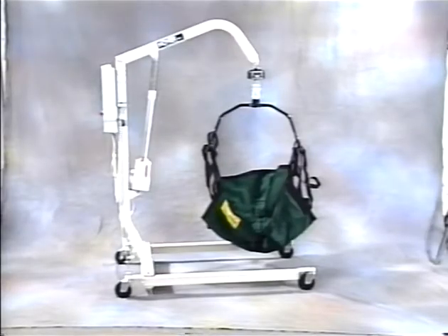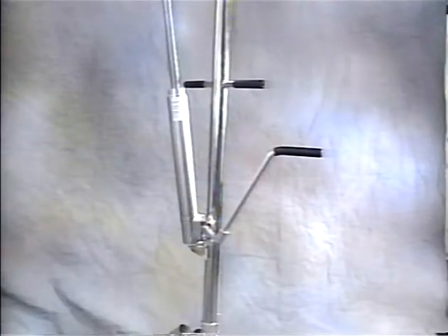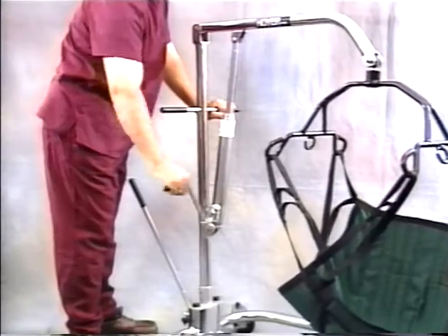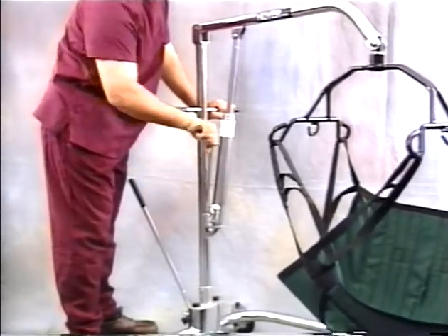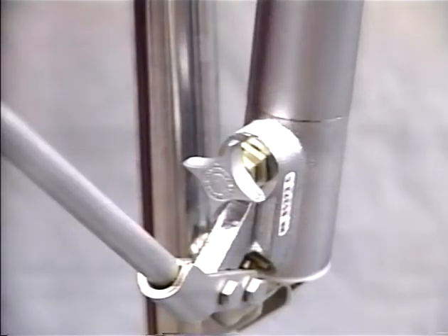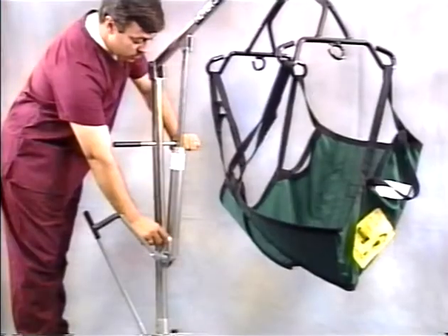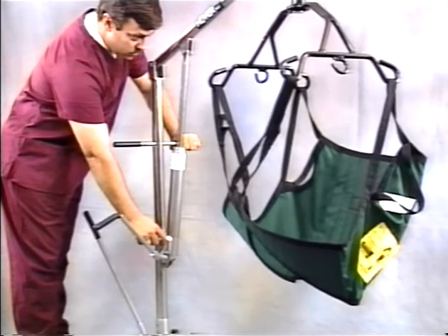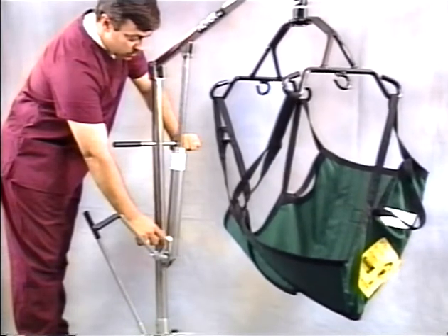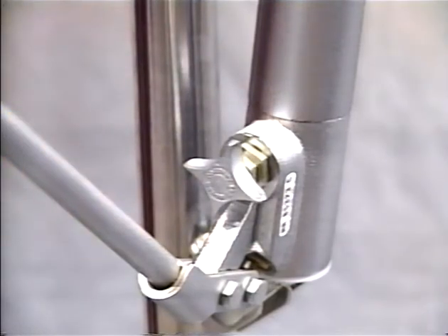Hoyer makes both powered and manual lifters. Manual lifters may be operated by hand crank or by a hydraulic pump. Long, smooth strokes activate the hydraulic pump. Turning the knob to the right, clockwise, enables the pumping action to raise your patient. Turning the knob to the left, counterclockwise, opens the valve and lowers your patient. It is extremely important to practice this lowering technique to assure a safe and smooth transfer for the patient.